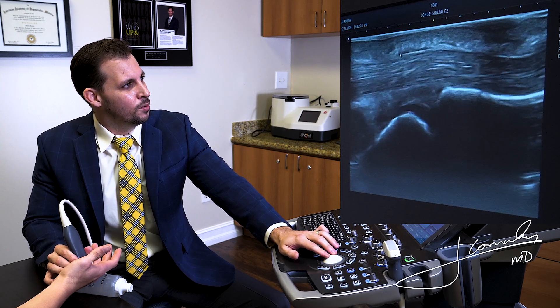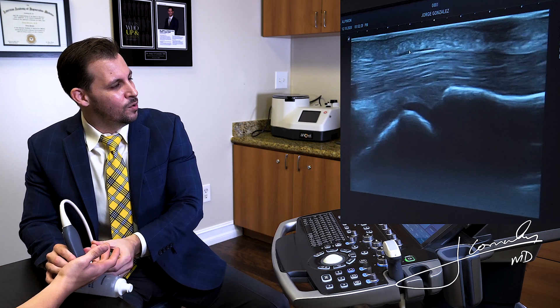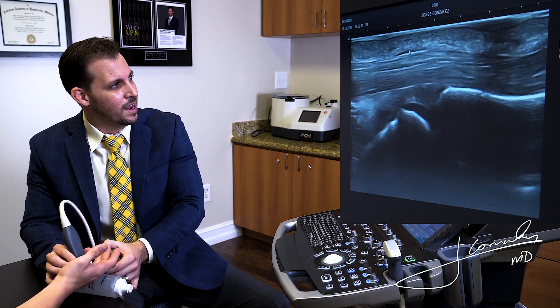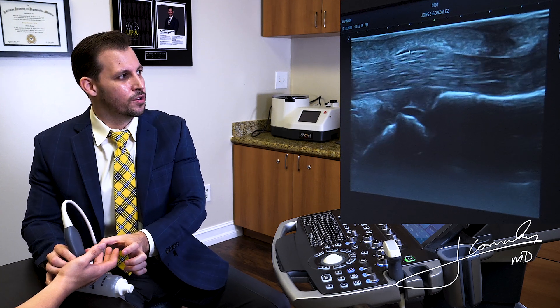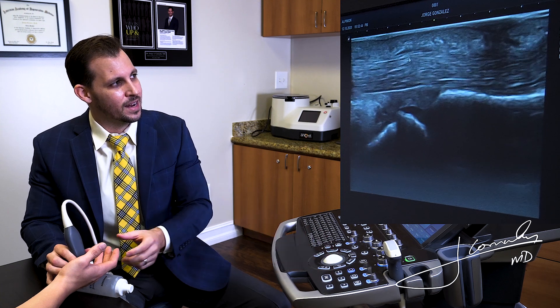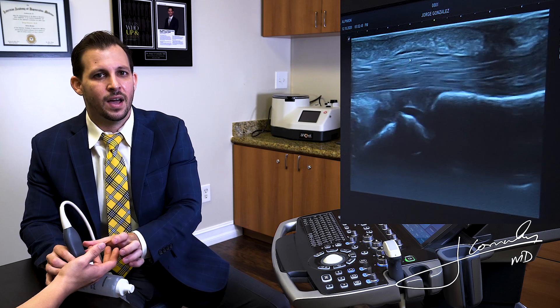Sometimes we can wigwag the probe a little bit so we can see the fibers and fascial changes, and right there we can actually see the flexor tendons sliding under the A1 pulley. In a pathological patient — one that has trigger finger — that pulley will be thickened and you can actually measure that. Most importantly, we can dynamically move the fingers and see the tendon catching or not moving as smoothly.